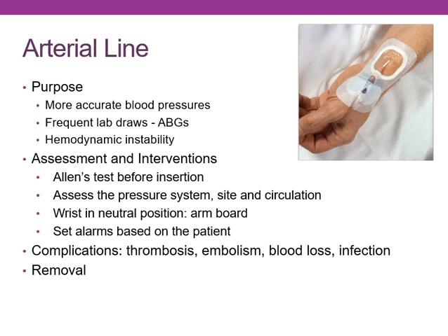Radial A lines are probably the most common. I have seen brachial, and on occasion we will have femoral. If you have an unstable post-heart cath patient, that sheath that they went through to do that heart cath, we can hook an arterial line up to it, and we've got an arterial line. Or maybe they're just so unstable they used the femoral artery because that's all they had, and their pressures were so bad that was the only pressure we could find. Those certainly need more pressure, at least 15 minutes.